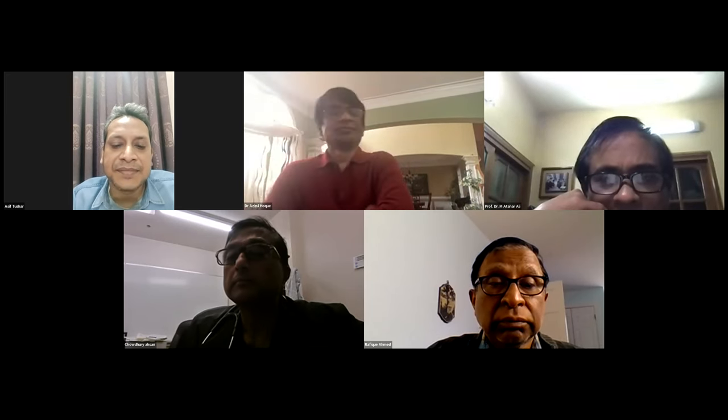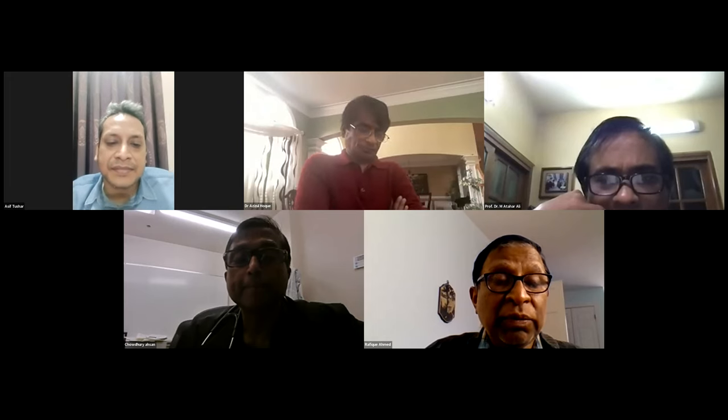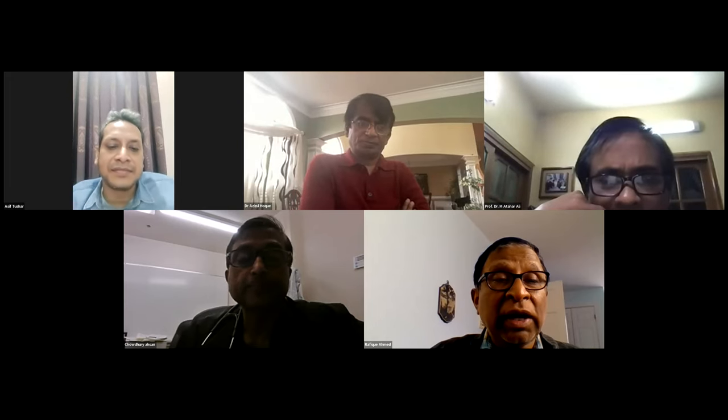I first would like to request Professor Rafique Ahmed sir to give his view, what he can do in the US, and then I'd request Wadud Chowdhury sir to give our perspective. Rafique Ahmed sir: Well, if somebody is in the ER, hemodynamically unstable, I think Hafiz will agree that if two physicians think that this patient's life can be saved by this fairly non-invasive procedure, you can proceed with cardioversion.